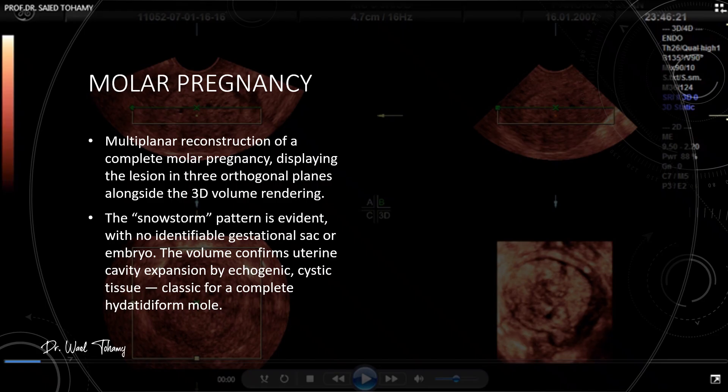Here we have a multiplanar reconstruction of a complete mole pregnancy, showing the lesion in three orthogonal planes alongside a 3D volume rendering. The snowstorm appearance is unmistakable and there is no gestational sac or embryo present. The 3D volume confirms that the uterine cavity is expanded and filled with echogenic cystic tissue — the classic appearance of a complete hydatidiform mole.